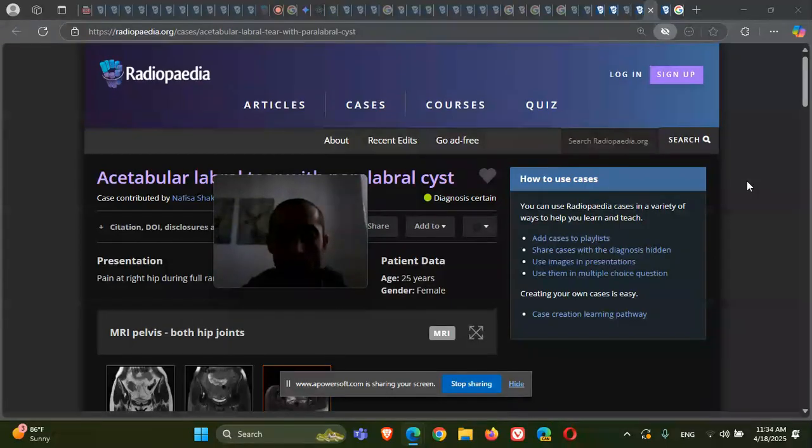Then we went to talk about the proximal femoral fractures: head fractures or neck fractures, intertrochanteric fractures, greater trochanteric fractures that may be the tip of the iceberg, isolated lesser trochanteric fractures which should be considered pathological until proven otherwise, and the subtrochanteric fractures. We talked about atypical fracture that may happen, for example, with bisphosphonates.